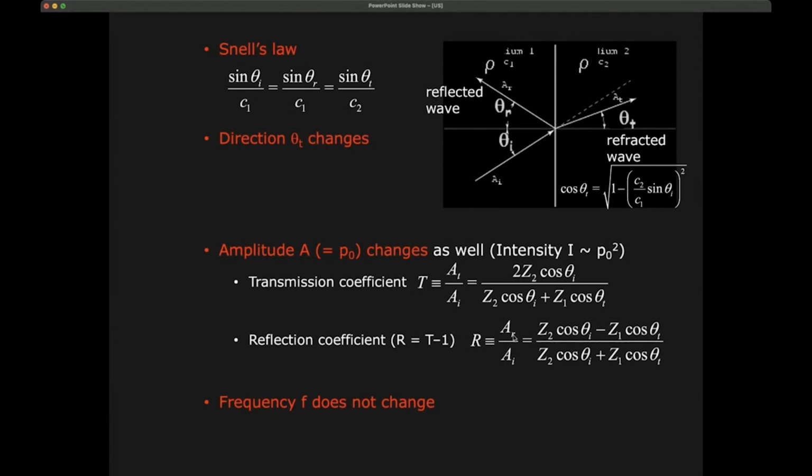When we now look at the propagation of these waves as they encounter inhomogeneities, we can see that there are two major types of inhomogeneities that we can look at differently. In the mathematical sense they are very similar to each other, but conceptually they are very different. To understand how ultrasound propagates through tissues, and how it propagates when we have different types of tissues next to each other, we simplify it by saying that we have two types of interactions.